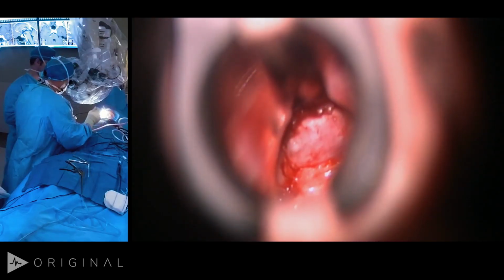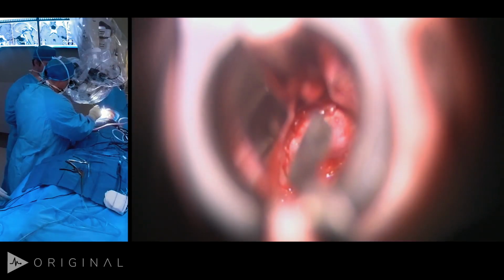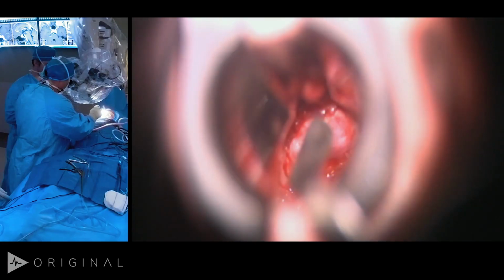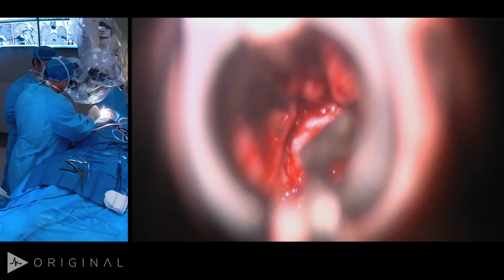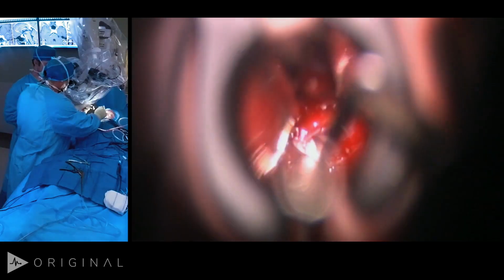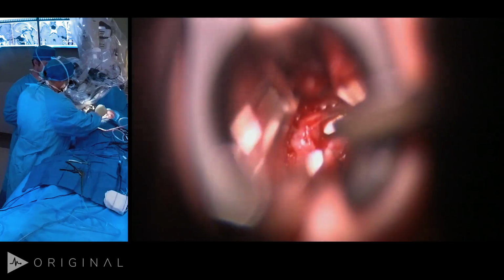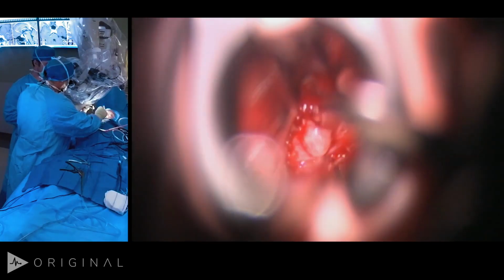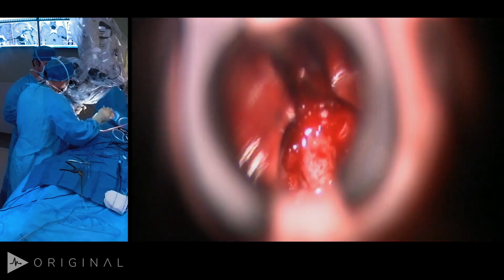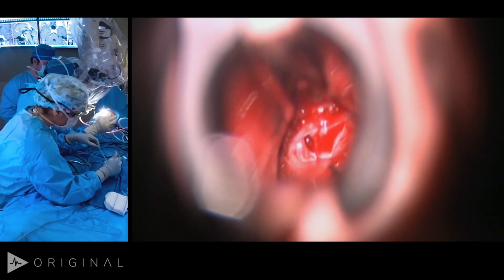So we will go ahead and make an incision in the dura. We agree this is midline? Yes, sir. Okay, so we'll make a small little slit. And as we predicted, there's going to be some bleeding because we know there are sinuses. Sometimes I'll do a subdural dissection with a little blunt ball tip dissector like that, because it's like popping a pimple. Punch, and there's the adenoma. So that's the adenoma. That worked pretty well, the subdural dissection, didn't it?